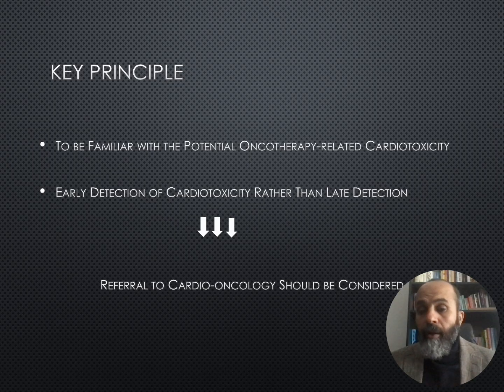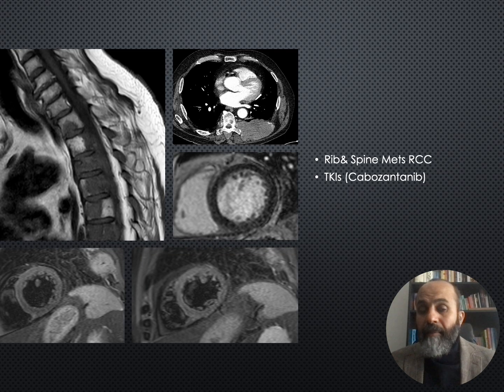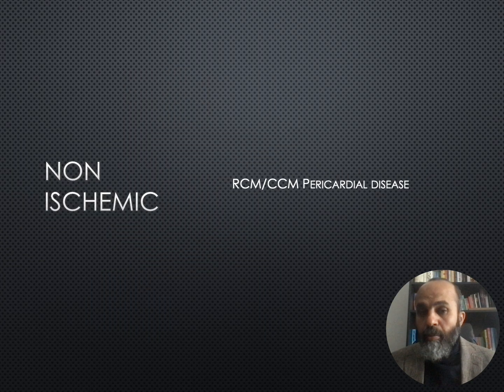And that takes me to a new era of myocarditis on top of oncologic therapies that sometimes lead to myocarditis. So we need to be aware of this entity. For example, in cases where there is advanced metastasis, and using those chemotherapies or the immune checkpoint inhibitors, sometimes they lead to myocarditis in the form of one criterion from the Lake Louise. It doesn't have to be the full-blown criteria, so you don't have to see late gadolinium. Sometimes only the edema would be diagnostic because myocarditis is fatal in this patient group.